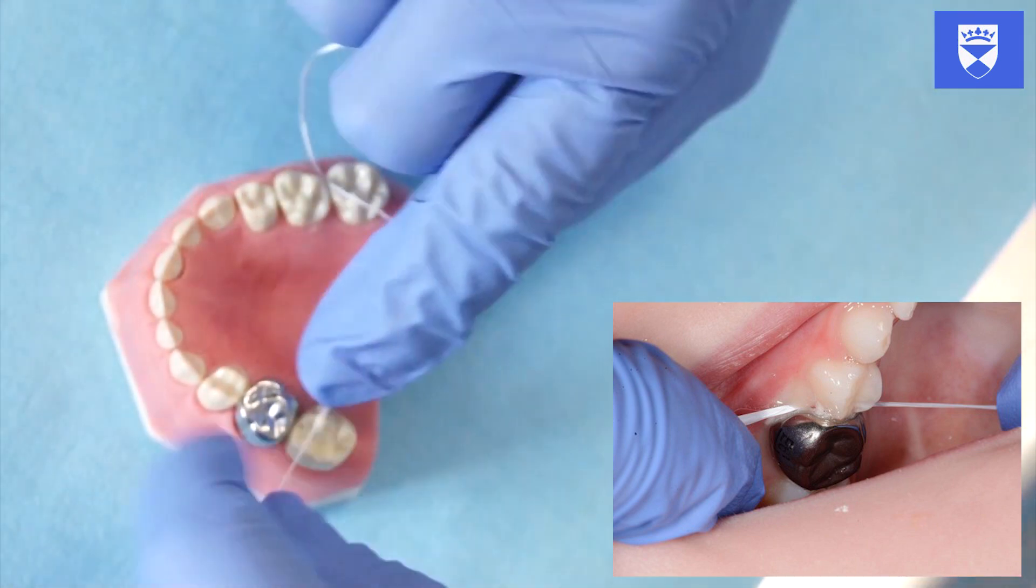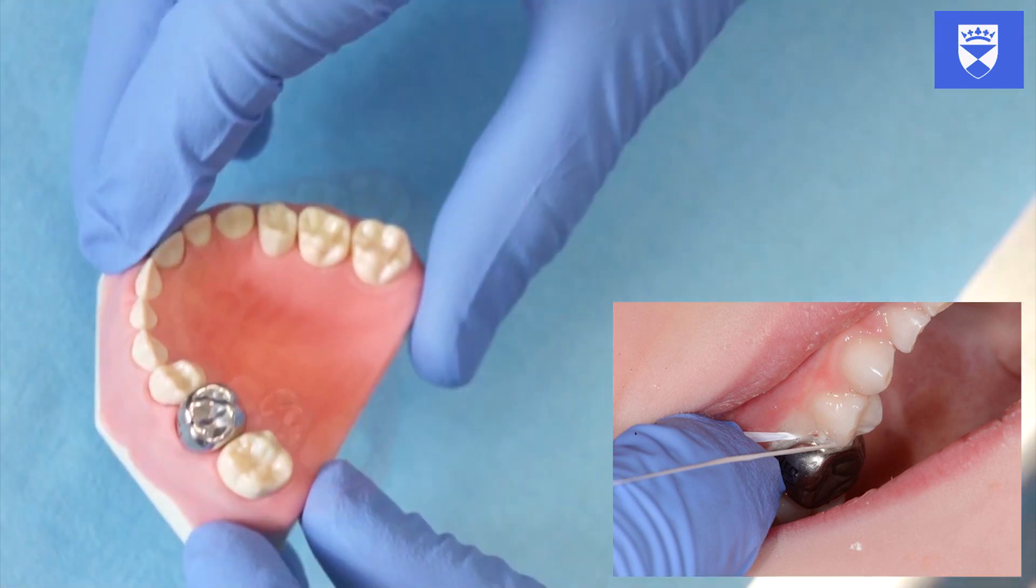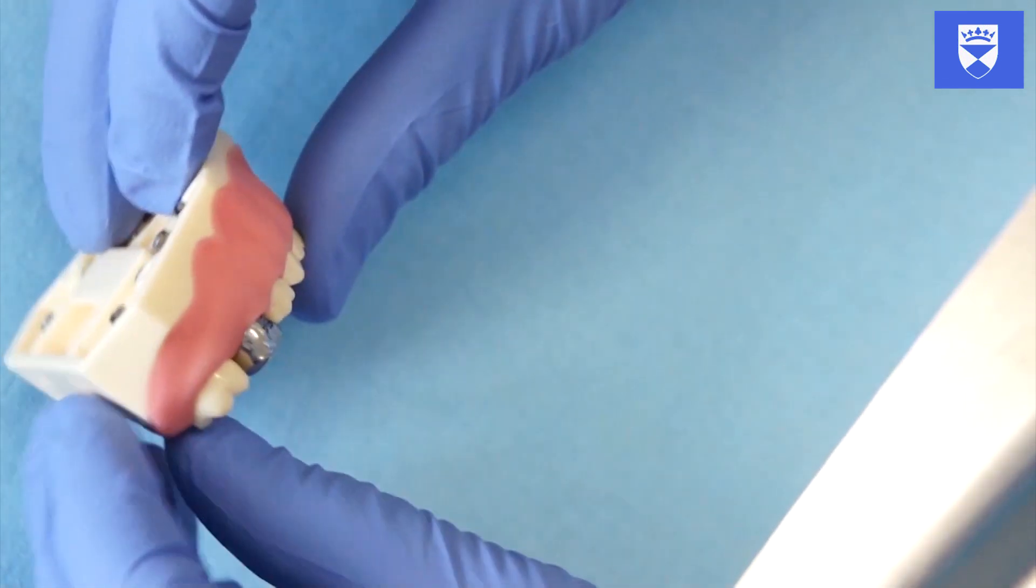If seated properly, the surrounding gingiva often blanches. Measure the overlap at the canines and record any increase in the occlusal vertical dimension in the notes.